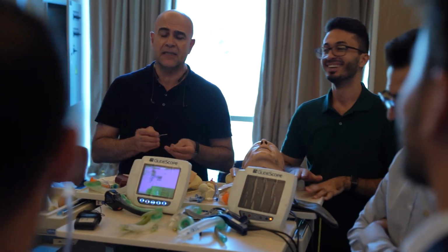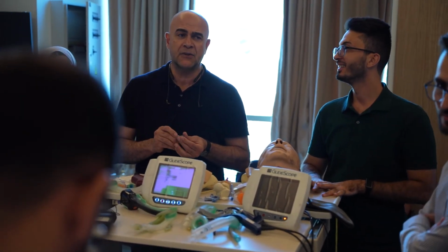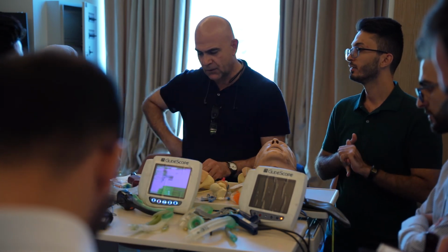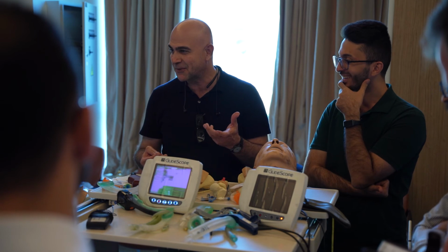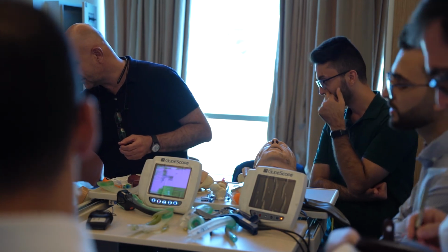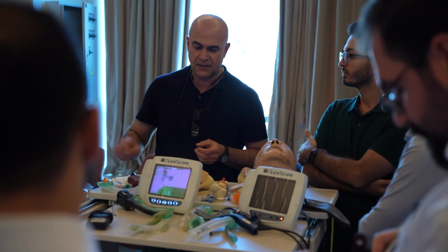Now let us review our summary. What is the indication of the intraosseous after 3 failed attempts of cannulation? Inaccessible vein, yes. What is the name of this metallic cannula? EZ-IO, this is a well recognized company called EZ-IO.